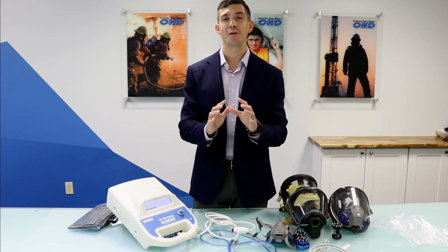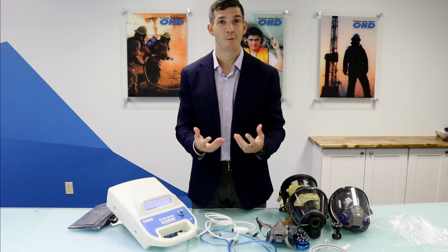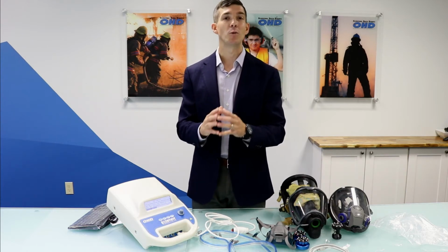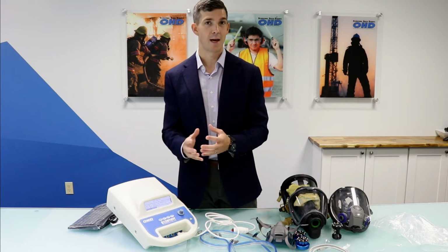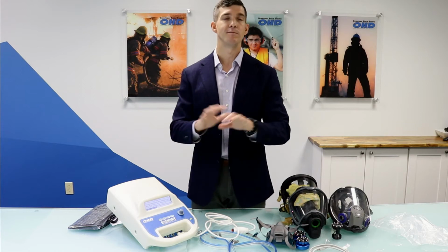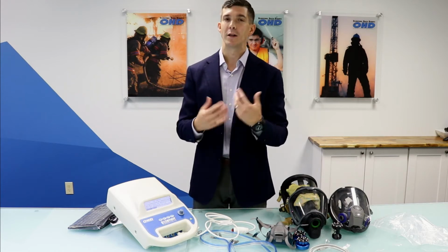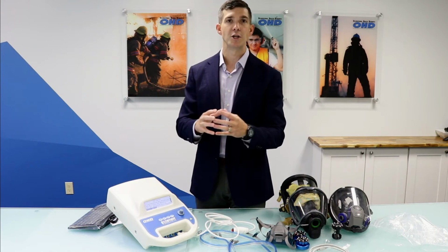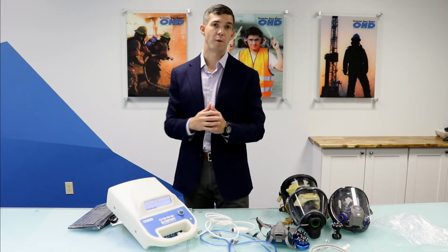So we get some really funny questions. People will say, do I have to calibrate this every day even when I'm not using it? Obviously not. This is only when you're doing testing today. Some people will even do this after lunch if they've gone and turned the unit off. You can do it as many times as you want to, but at least do it daily of testing so that you know the instrument's in calibration and in standards for all the tests you're about to conduct.